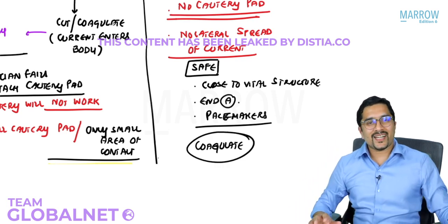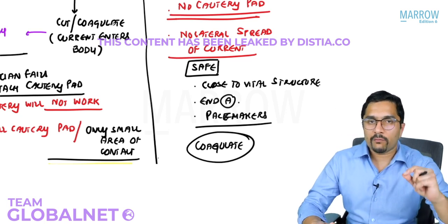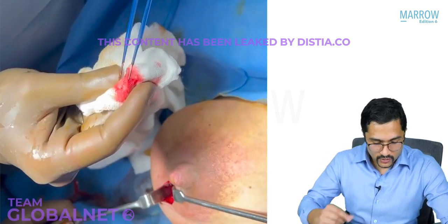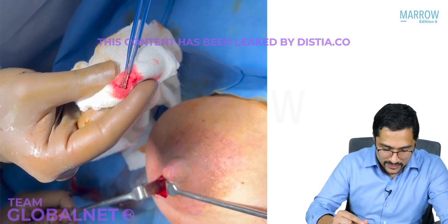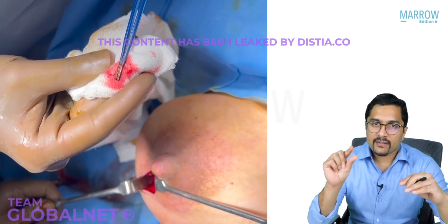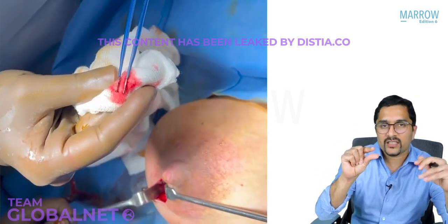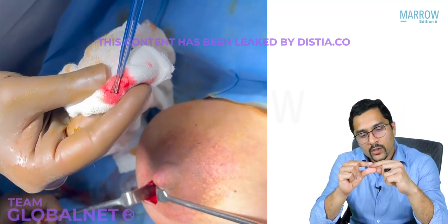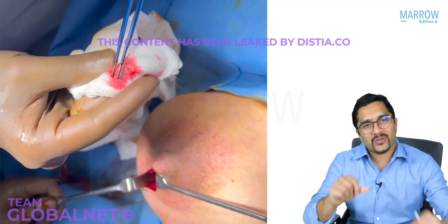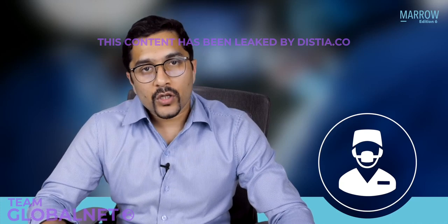So these were the points regarding bipolar cautery which I wanted you to know, and I'll quickly show you a video of bipolar cautery being used so that you understand the difference between the two. So you can see this is the bipolar cautery in my hand, and I'm just using it over a gauze piece, not over the tissue, just to demonstrate that when I get the two prongs close to each other, it'll cause coagulation in that area. So current will come through one prong and it will go back through the other prong. So that was regarding monopolar cautery and bipolar cautery.